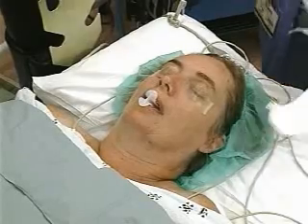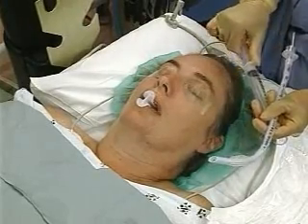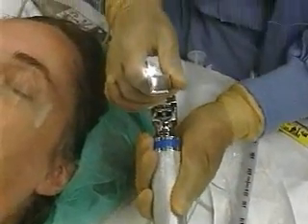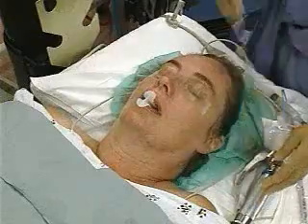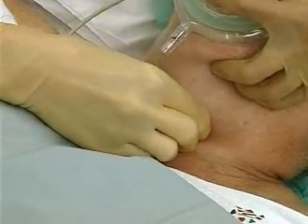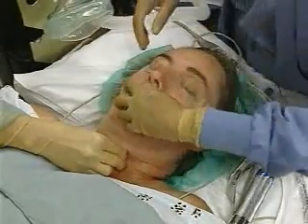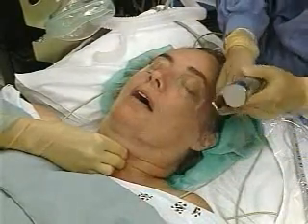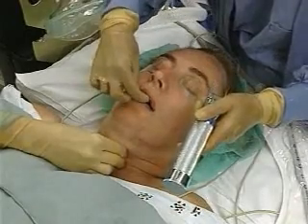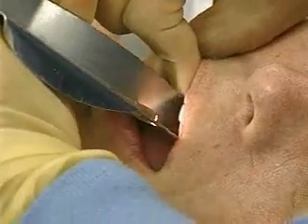Check the endotracheal tube cuff for leaks by inflating and deflating the balloon with 10 milliliters of air. Check the laryngoscope to ensure the light is functioning. Pre-oxygenate the patient with bag-mask ventilation. Have an assistant apply cricoid pressure using the Sellick maneuver. Remove the oral airway, grasp the laryngoscope in the left hand, and instruct the awake patient to open the mouth as widely as possible. In the unconscious patient, place the thumb and second fingers of the right hand on the upper and lower right molars and open the mouth with a scissor-like motion.